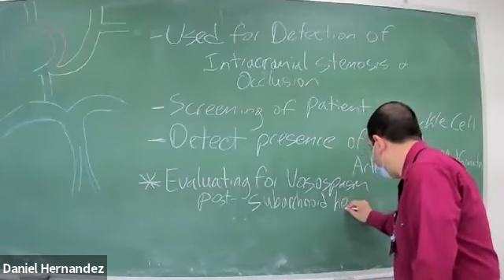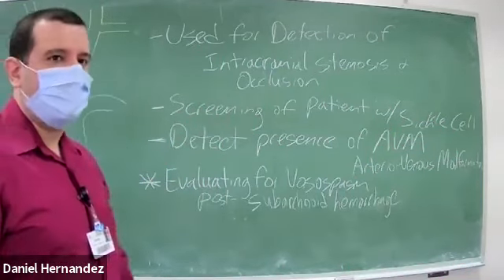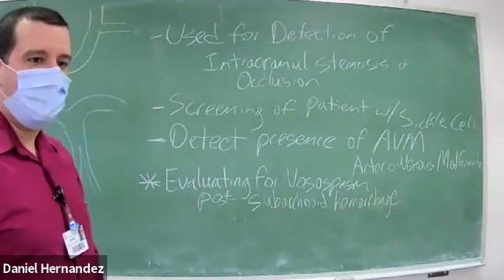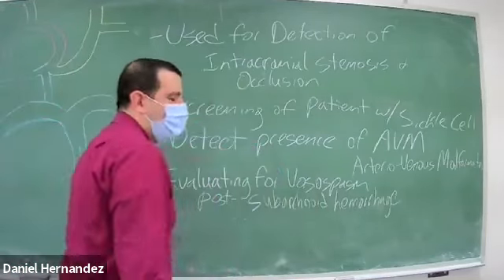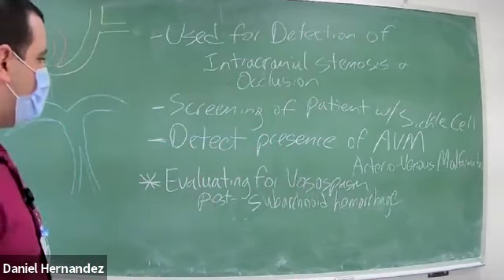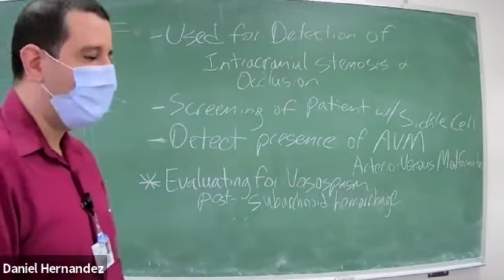We're going to go into a little bit later exactly what vasospasm is, but it's a condition in which, when a patient has a brain bleed, that extra pressure from the brain bleed puts pressure on the vessels, causing a constriction or a narrowing of the vessel, and thus creating a stenosis and increasing velocities within the brain. So post a brain bleed or subarachnoid hemorrhage, transcranial Doppler plays a critical role in assessing for the presence of vasospasm because it can lead to compromise of the brain tissue.